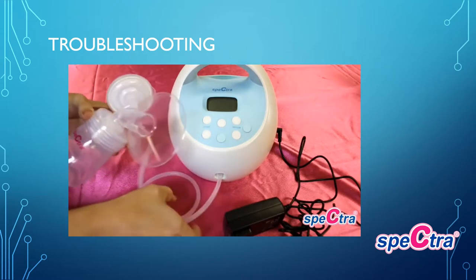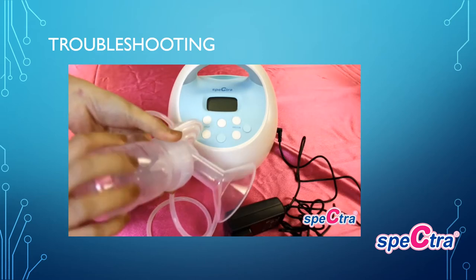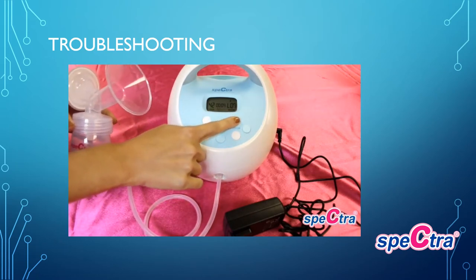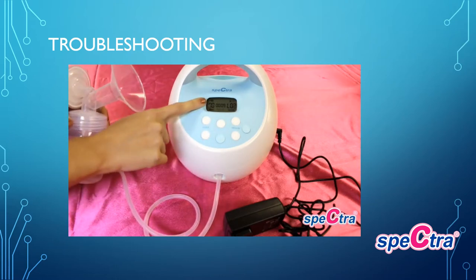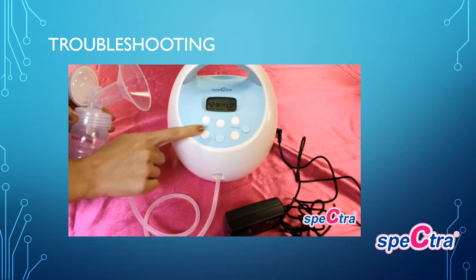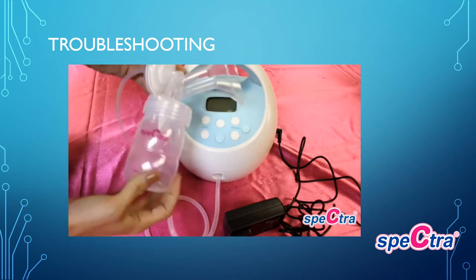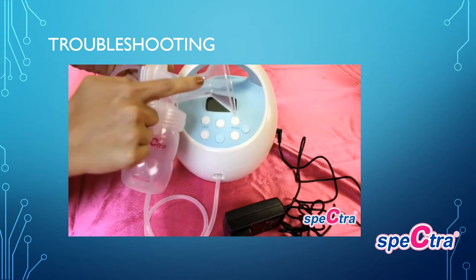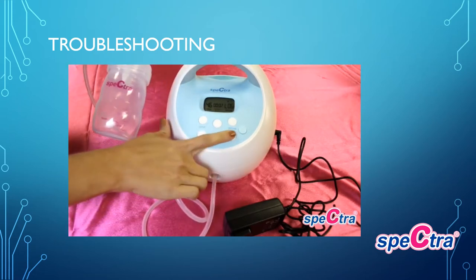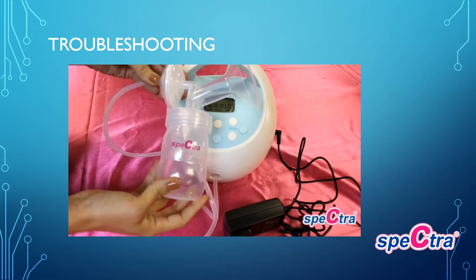For troubleshooting low suction, make sure all your parts are assembled correctly, there are no holes in the air tube, backflow protector membrane, or duck bill valve, and that all parts are firmly screwed on. Also make sure your vacuum level is increased. If you are having trouble with massage mode being set at 70, that is correct — it should not adjust up or down; only in expression mode should your pump be able to change cycles. If you are experiencing pain while pumping, check your breast shield size and make sure your nipples are not rubbing on the edge. Also check that the suction level is not too high — try decreasing the suction strength. You should not experience pain while pumping if pumping properly.